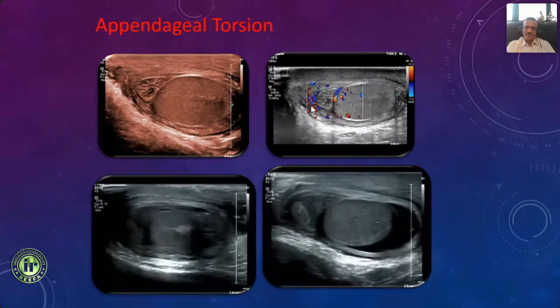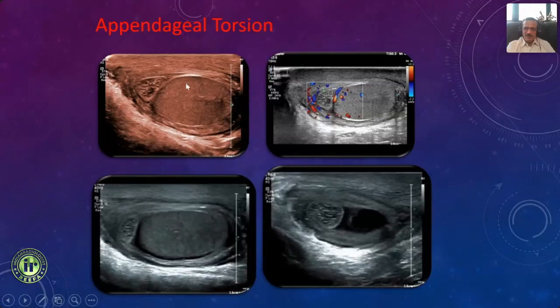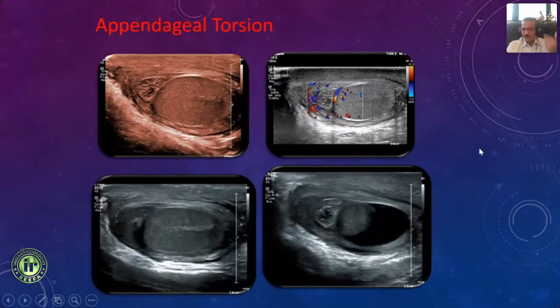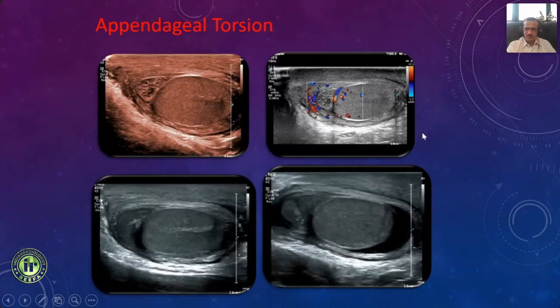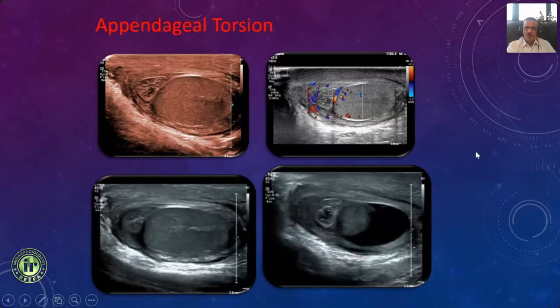Okay, fantastic. So what we need to remember here is that this is a classical appearance, and this is in fact much more common than actual testicular torsion. We see this very often. And they have that blue dot sign where there's a discoloration on the scrotal wall, which is supposed to be diagnostic. You have this typical appearance. You may not see color flow there.